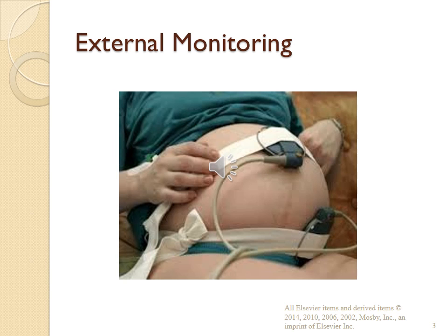Frequently, continuous electronic monitors are used in the hospital setting. Continuous monitors are able to assess subtle changes in the fetal heart rate that may go unrecognized by auscultation. Toco transducers, which are placed on the abdominal wall to detect uterine activity, are used, such as seen in this picture. Ultrasound transducers, also placed on the abdomen, are used to detect fetal heart rates.